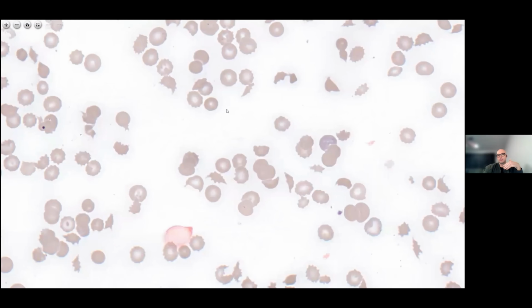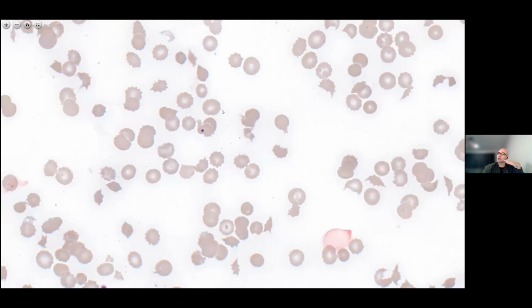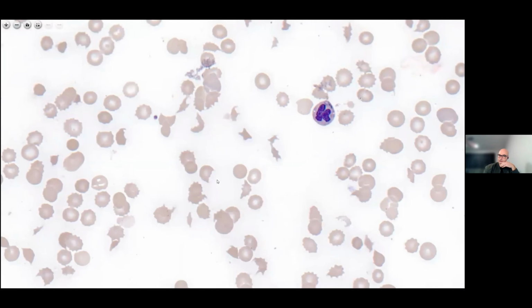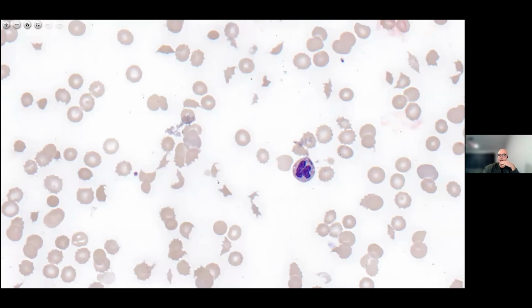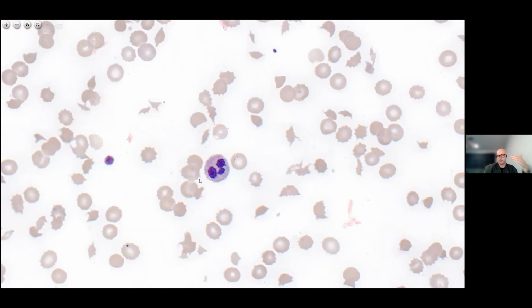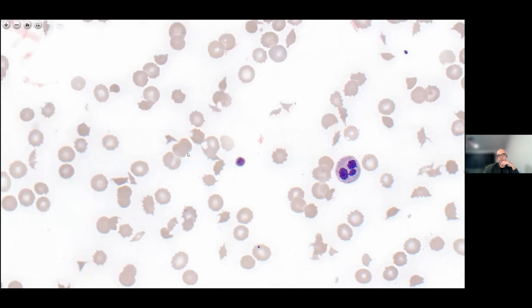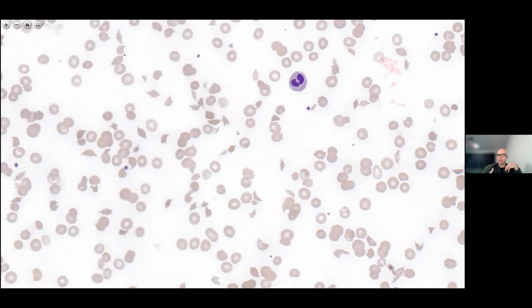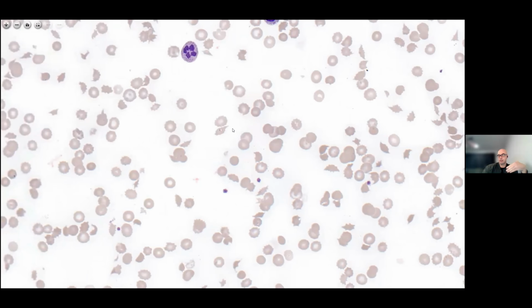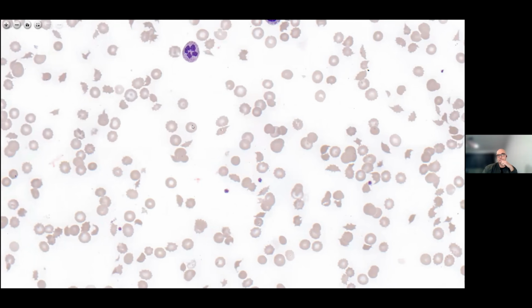And the degree of polychromasia on a film doesn't always directly correlate to the number of these immature red cells, which are called reticulocytes. So a reticulocyte count, whether it's manual or automated from an analyzer, is the best way to report the actual reticulocyte concentration and percentage for a full blood count. At my laboratory, we don't get too carried away with grading the reticulocyte level. If we see enough that we believe it's significant, we just report that there is significant polychromasia present on the blood film.